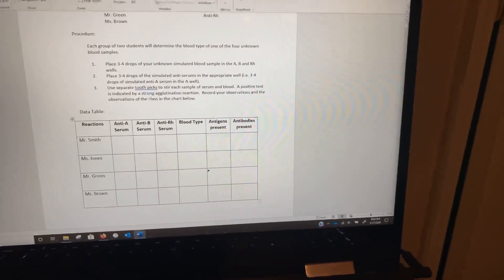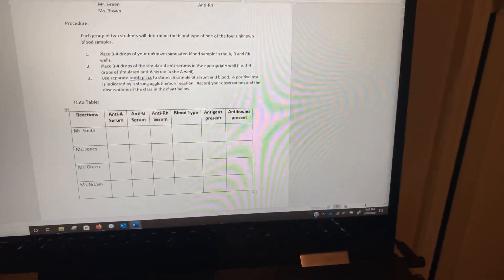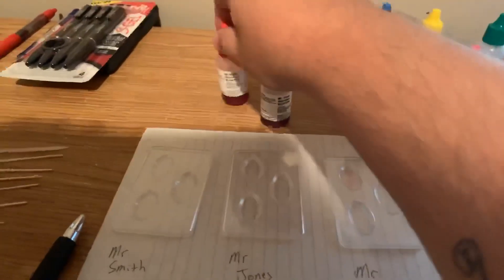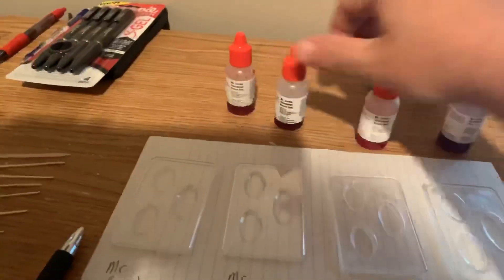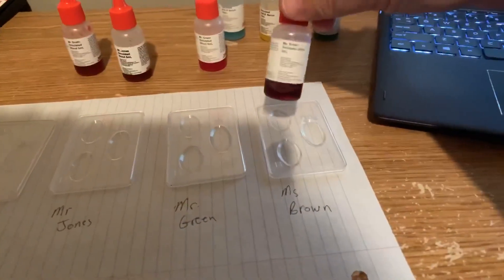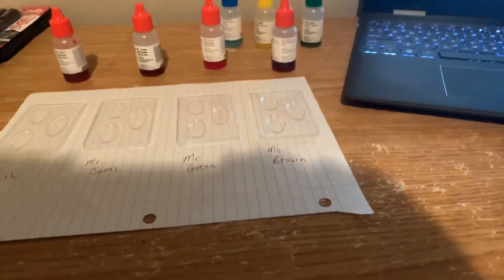I'm not going to give you the answers — you're going to have to figure out what blood type they have based on what we see in the activity. I've got four blood wells labeled with fake blood. The first is Mr. Smith, next is Mr. Jones, then Mr. Green, and last, Ms. Brown. Those are the four unknown blood samples, and we want to figure out what blood type they have.